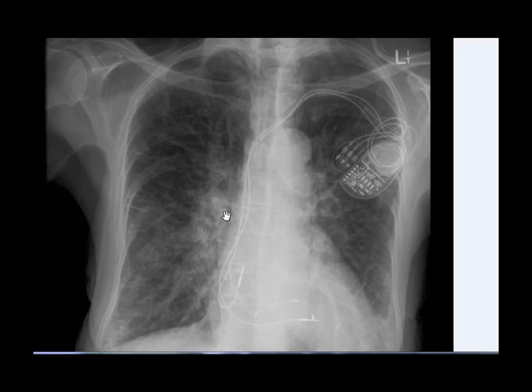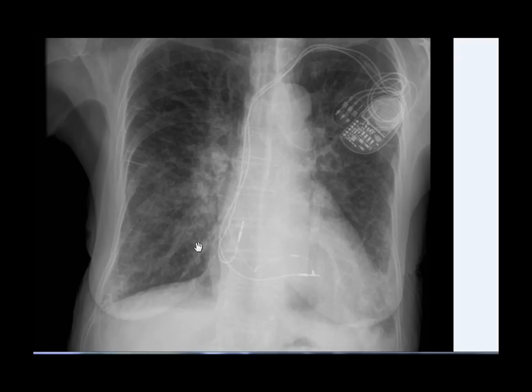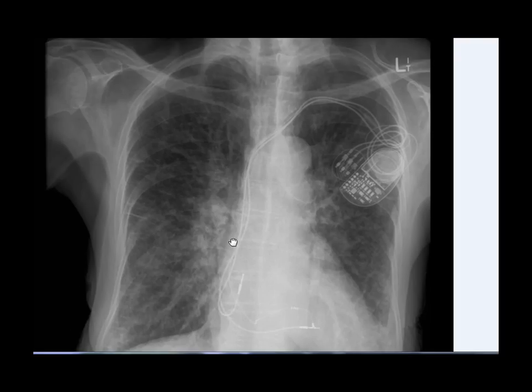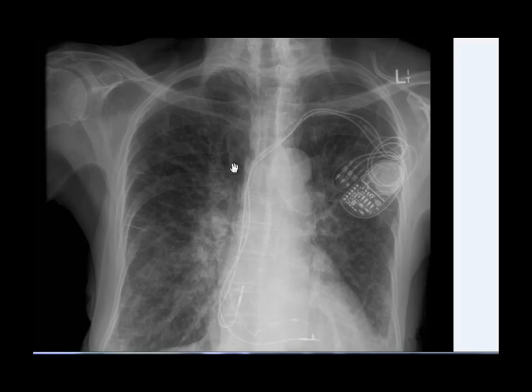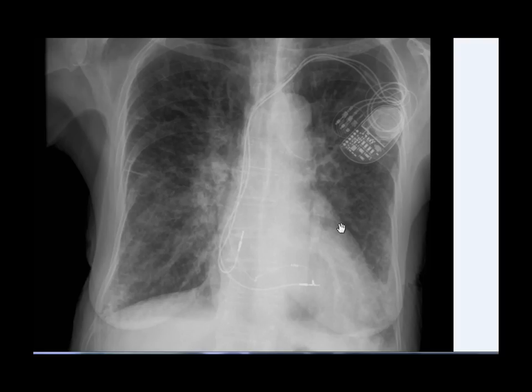The second feature is prominence of upper lobe vessels. The upper lobe vessels have become larger than the lower lobe vessels and are much more clearly visible in the upper zones compared to the lower zones.